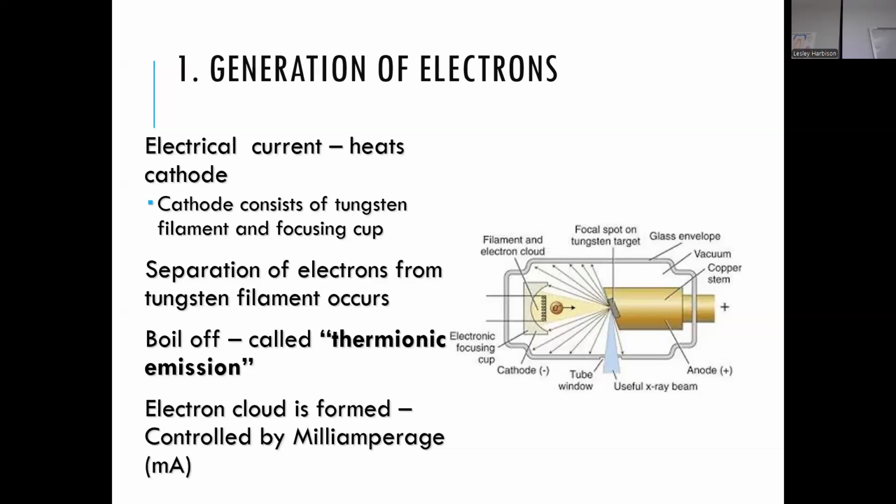And then down on the bottom of the control panel, outside of the X-ray room, it's just stamped on there, 7 MA. And MA stands for milliamperage, which is the power setting that controls this process that we're talking about right now. So all you really have to know, you don't have to know much more, like, I don't understand what milliamperage is and all this kind of stuff. All you have to know and memorize is that milliamperage, and we just shorten it to MA because it's easier to say, controls this first process of generating available electrons. It's controlled by the milliamperage.